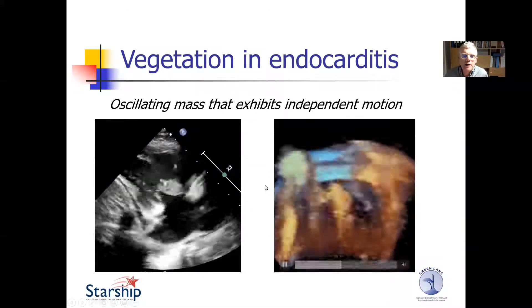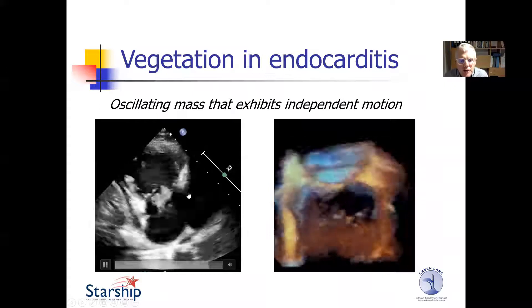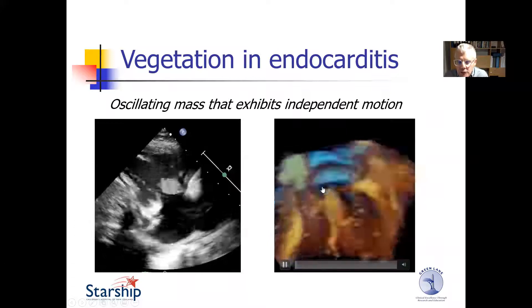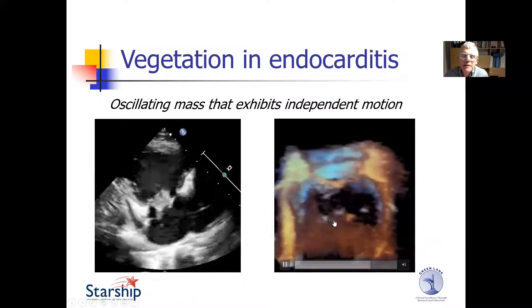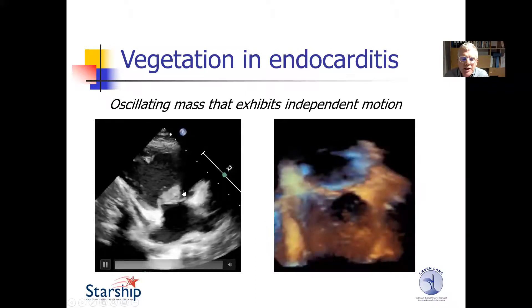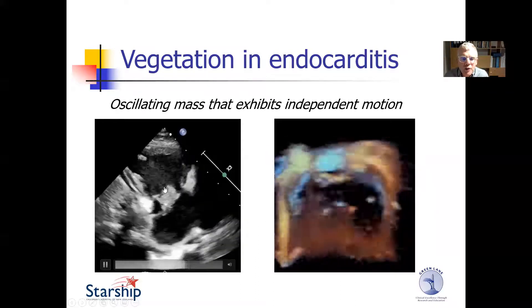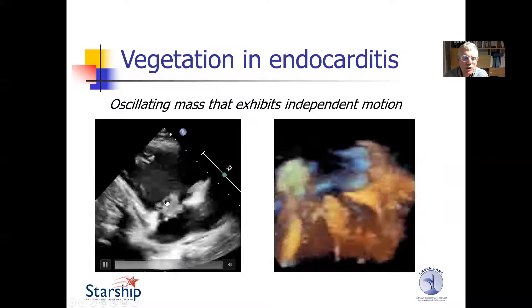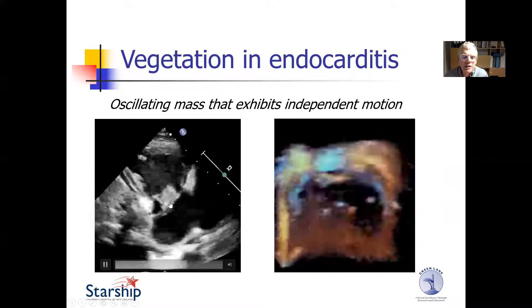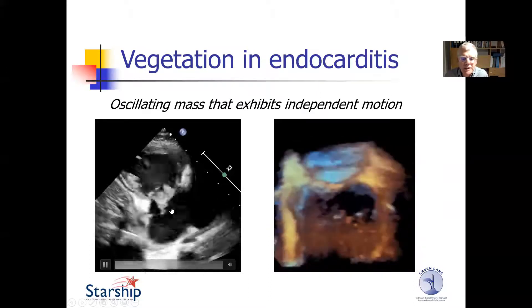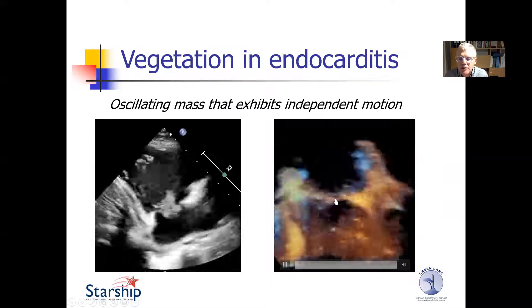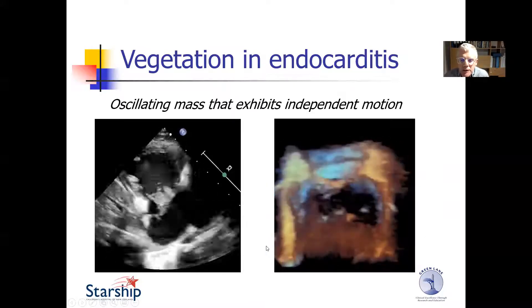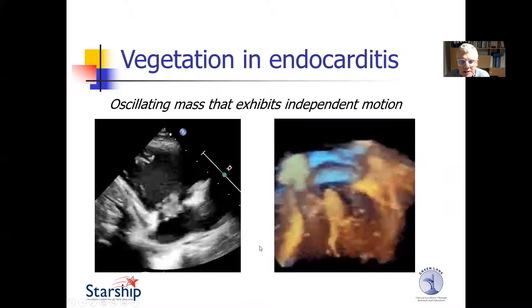If we look at these echocardiograms, this is a staph tricuspid valve endocarditis. This is a Corynebacterium endocarditis on a mitral valve. You can see how this oscillating mass exhibits independent motion — motion independent of the actual valve. There's all kind of material flapping around here. And this is a fairly dramatic 3D image of a very large, nasty vegetation — it looks like a rat eating the mitral valve.